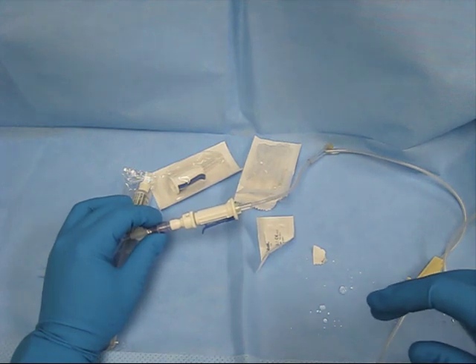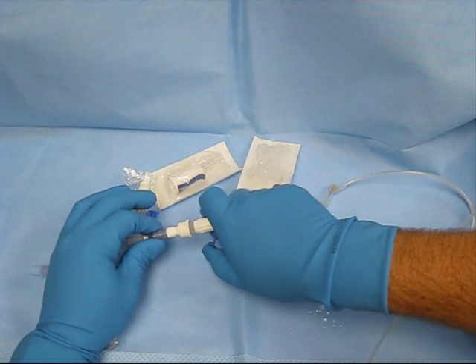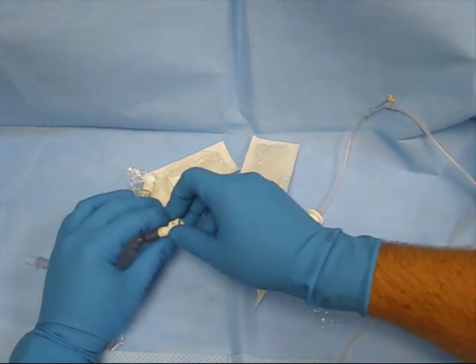Once you're completed with your infusion, you can pull this back, take this off, leaving the connector connected to the patient.